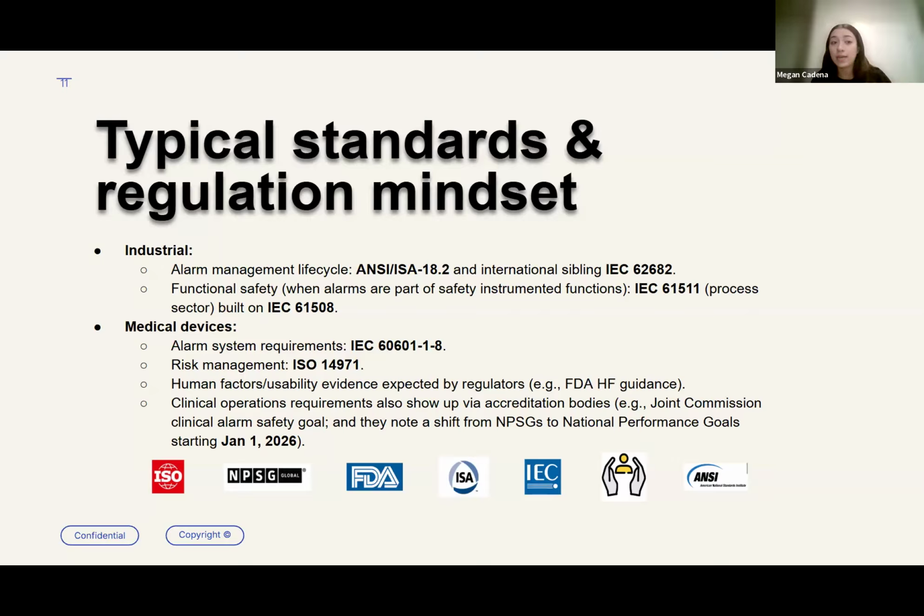And this falls into that category of usability. And then fourth, I would say every standard, there's going to be a standard for quality control or quality systems and management. So this would be good old ISO 13485. How do you control your DHF? Any change controls or design changes would fall into that.